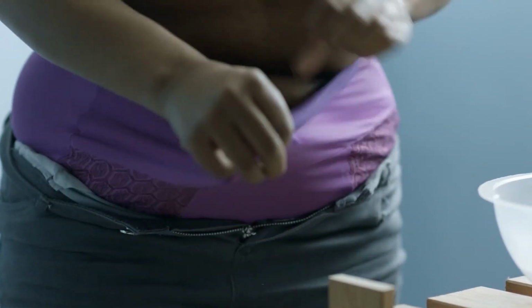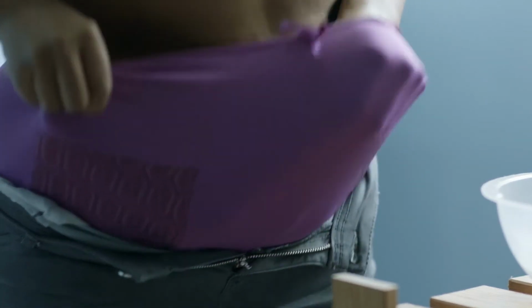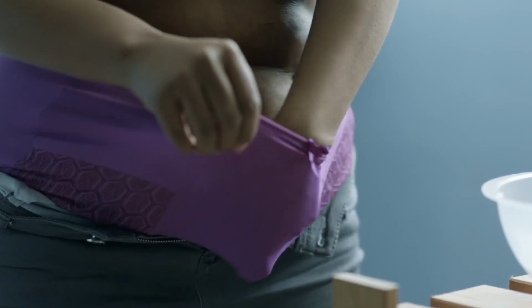One thing that a lot of new ostomy users worry about is leakage. What I would say to them is, as long as you've got the right products, as long as your template is cut correctly, as long as you're doing your ostomy check, you shouldn't have to worry about leakage. If you've got the right products for your ostomy, you shouldn't have a leak. However, occasionally blips are gonna happen. It's gonna happen. Deal with it, clean yourself up, and move on. It's just food.